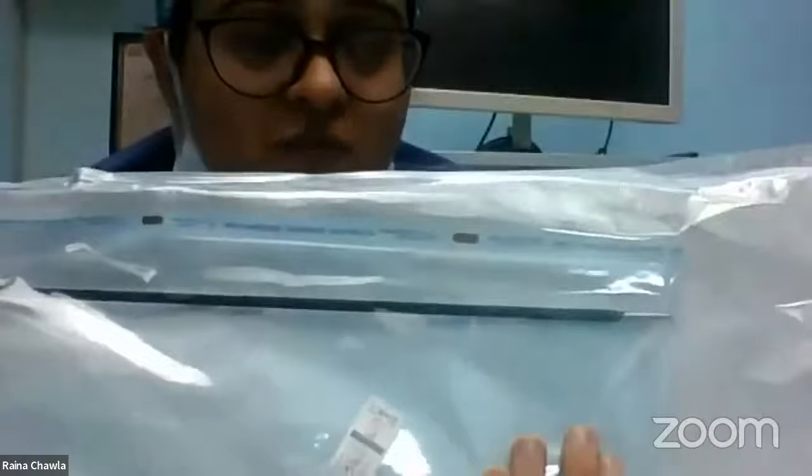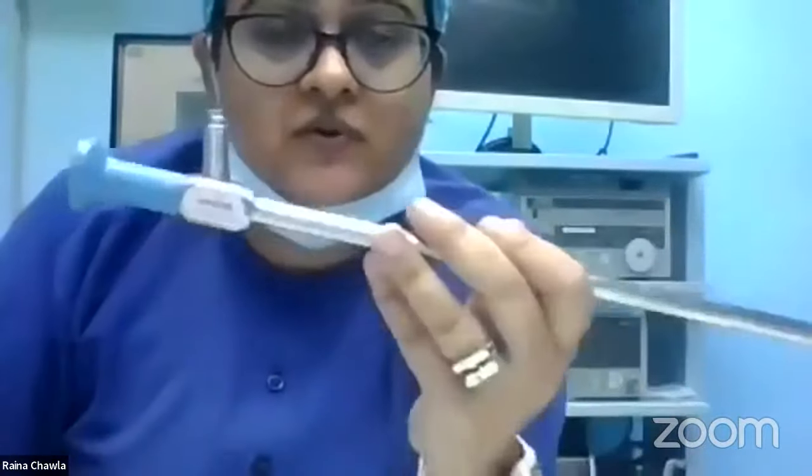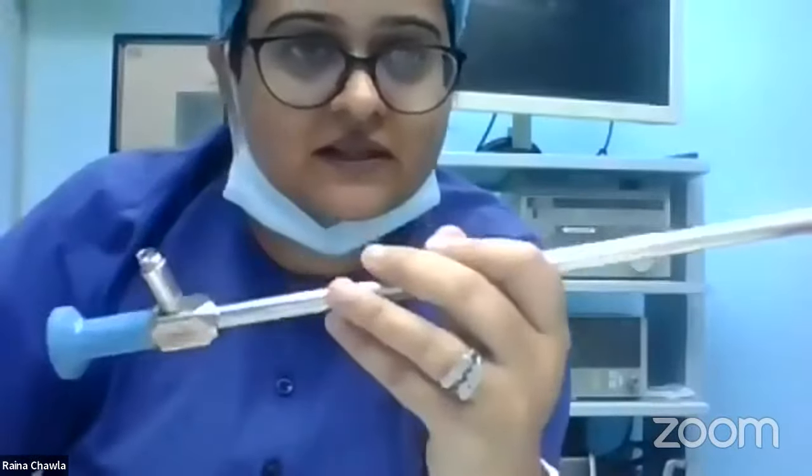And there are different instruments. This is a grasper. You can have scissors. You can have graspers. You can have suction cannulas. You can have electrocautery instruments. So different instruments go in through the secondary ports. Through the primary port will be our camera system with the scope with the light source. Okay, is this clear so far? Yes, ma'am. Okay, so I will repeat.